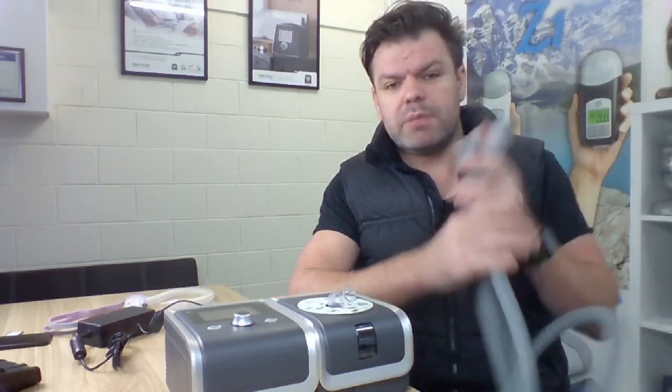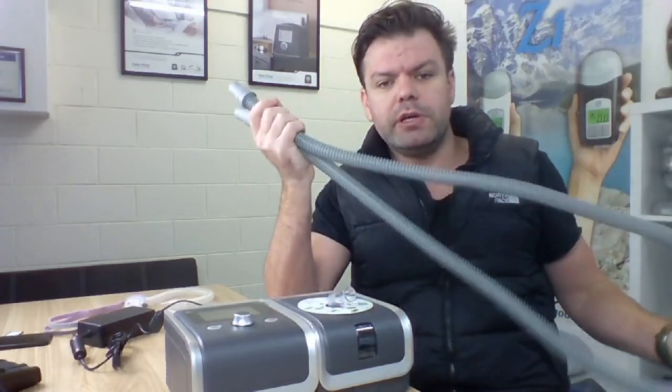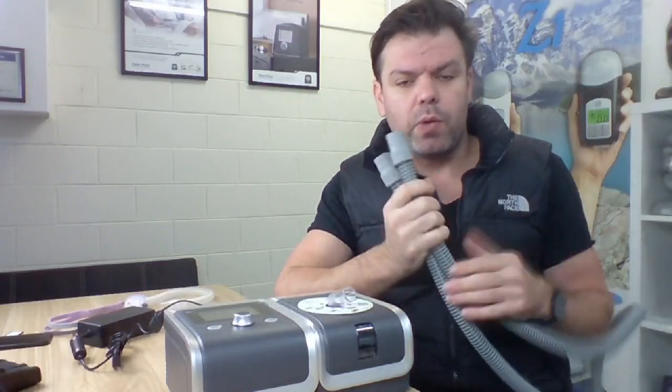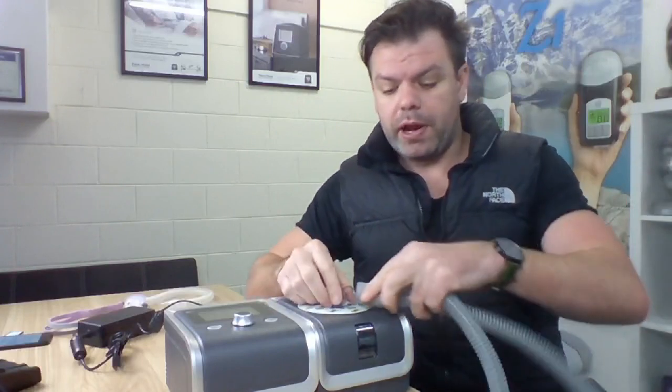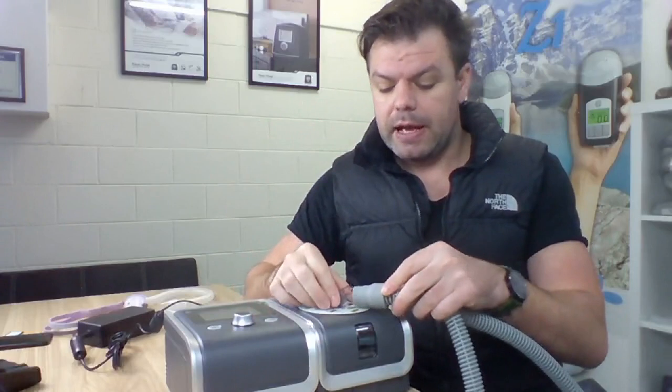Okay, so that'll work. Another thing you can do is buy these tube cozies, which are like insulated covers for the tubing, and that way it'll keep the tube insulated as well, keeping the air inside the tube away from the outside cold temperature, especially where we are at the moment, Melbourne. We're just coming into winter, and it is starting to get cold, and we're already getting phone calls from people trying to run a lot of humidification and getting condensation. Okay, but we'll talk about that another time.